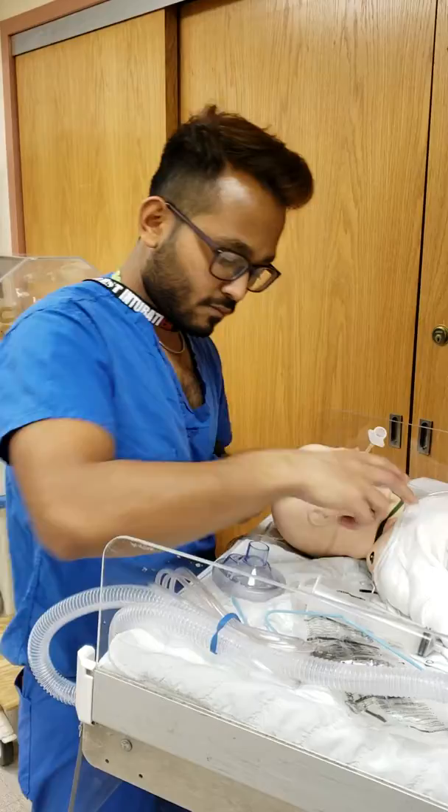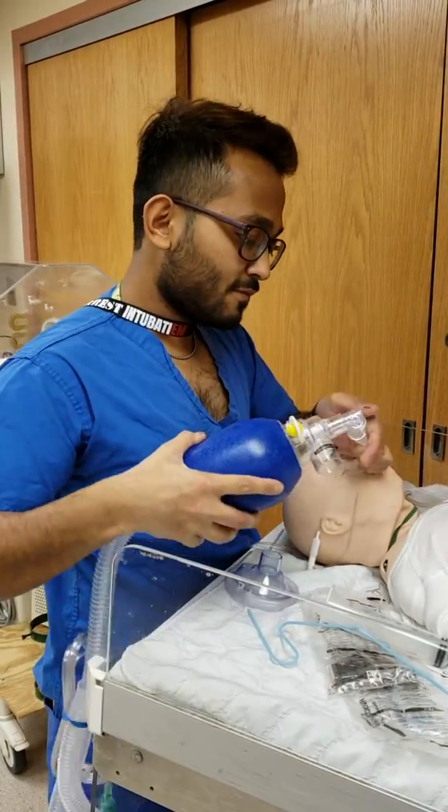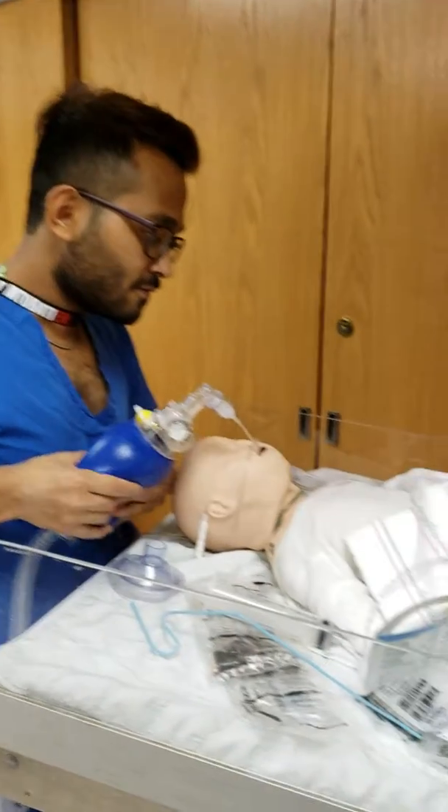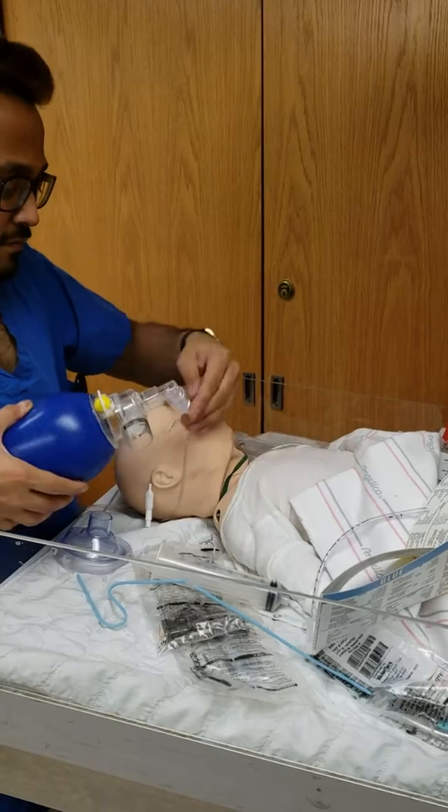We're going to bag — we're just going to do mouth-to-tube. A little shallow. Can you go a little deeper?